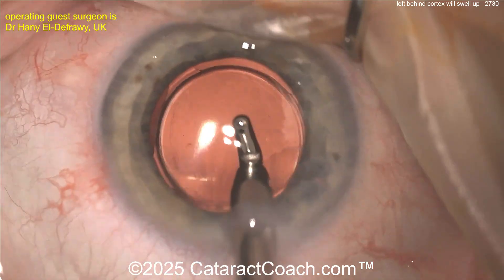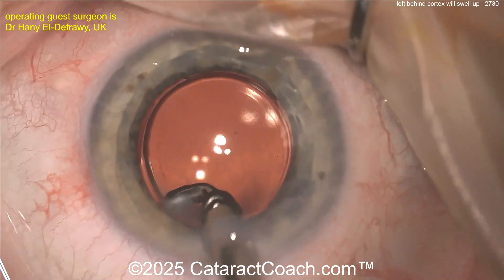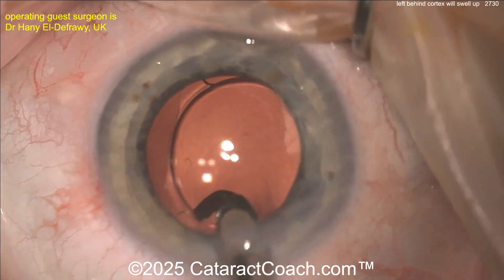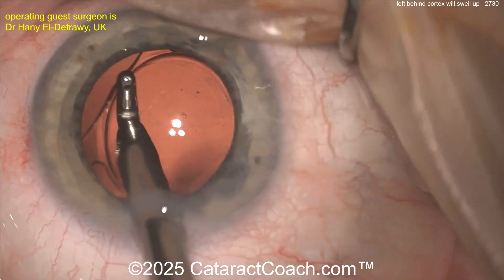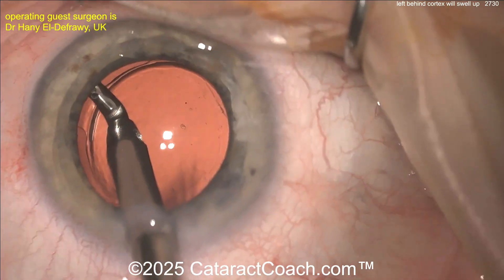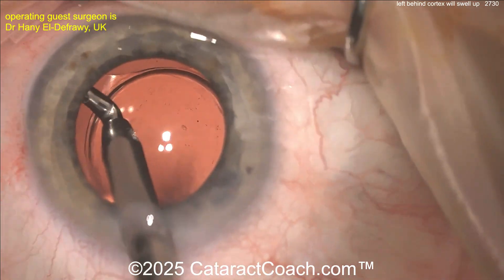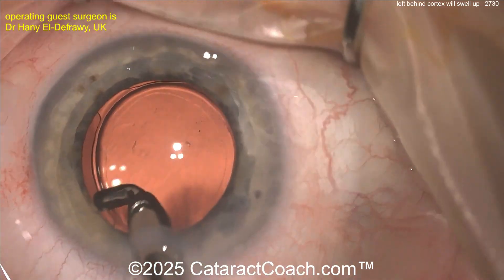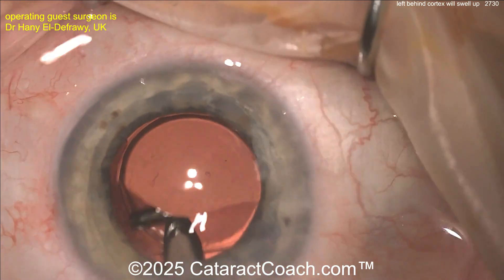With the IA probe everything's being cleaned out — whoa, look at that, some hidden material there subincisionally. Take your time to get a nice thorough cleanup and get all the material out of the eye. That is fantastic. Once this is all cleaned up, the patient is going to be very happy, and there will be a lot less inflammatory load.